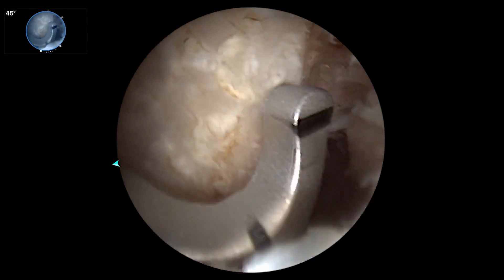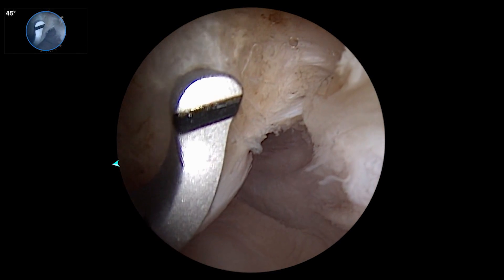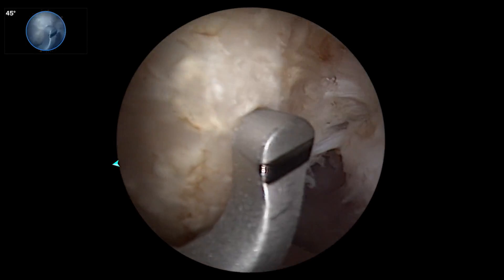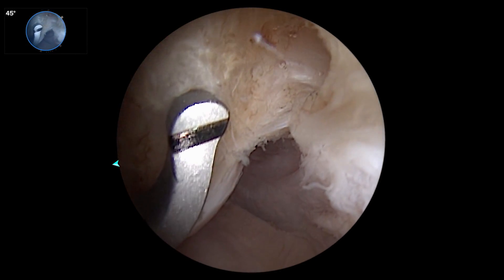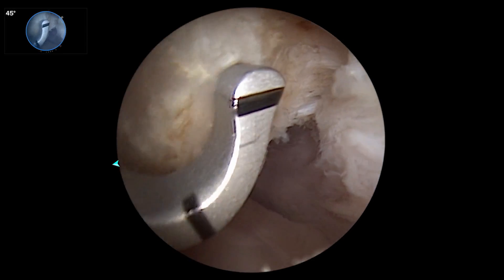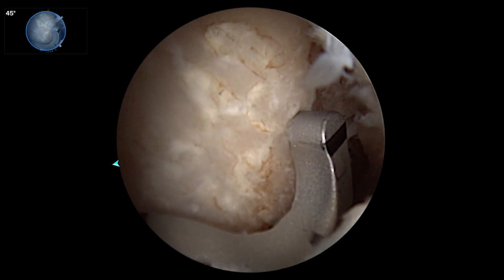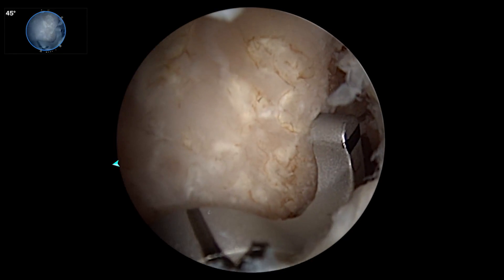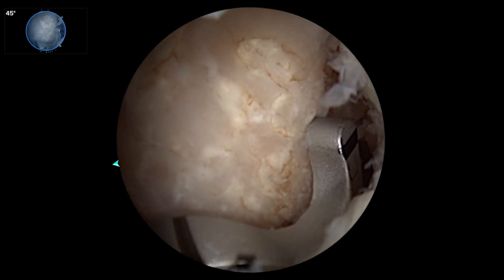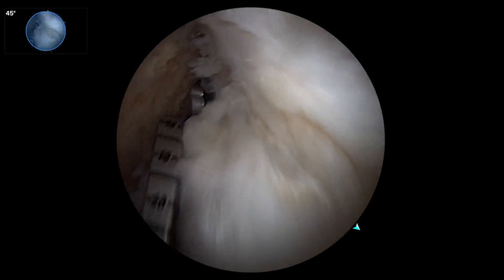When I'm looking back to the left, this is a view that, as much of this as I do, I've probably never seen with this wide-angle view. Here's the lateral wall and back, there's over-the-top and the back, there's lateral meniscus below and the posterior compartment. As much of this as I do, this is a view I've really never seen before. So I'm going to be very confident that I am repairing back to an anatomic location, which is one of the most difficult parts of a repair when you're working around an ACL in the notch.